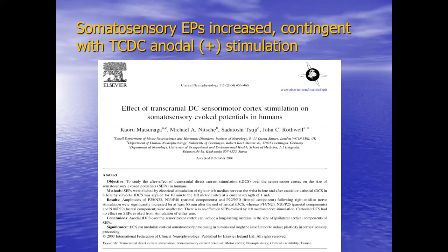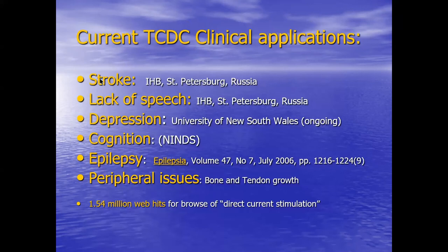There are studies on stroke. This was hemifield neglect in people that had a right hemispheric stroke, and they had hemifield neglect to the left side. They were treated with a DC stim. Their function improved to the point where they were able to pass their driving test. Now, I don't know if I want to go driving in St. Petersburg now, but hemifield neglect is a dangerous thing if it's there. But if you treat it effectively and you can pass the exams to drive, I guess you're a driver again.